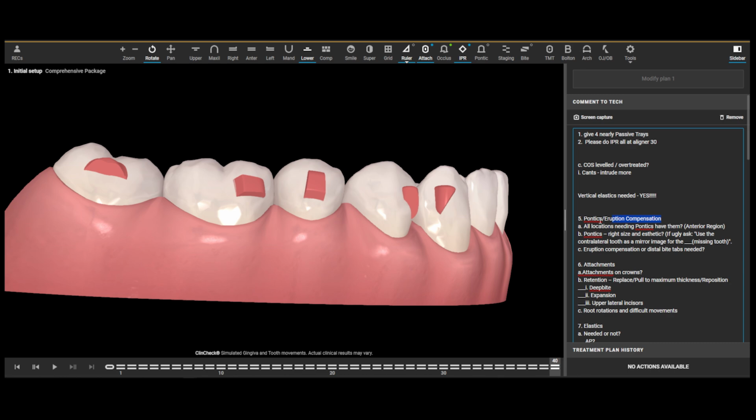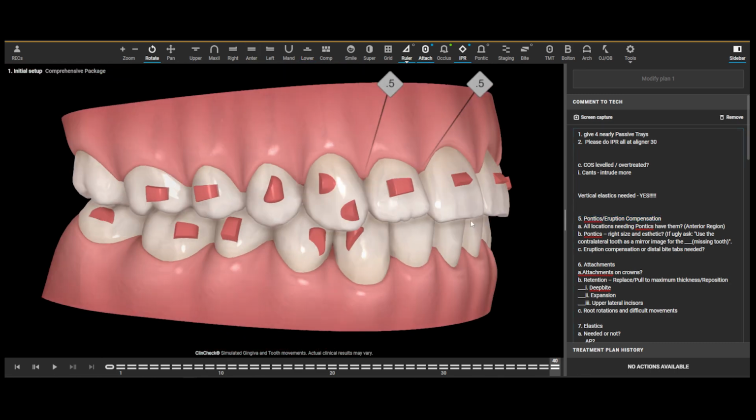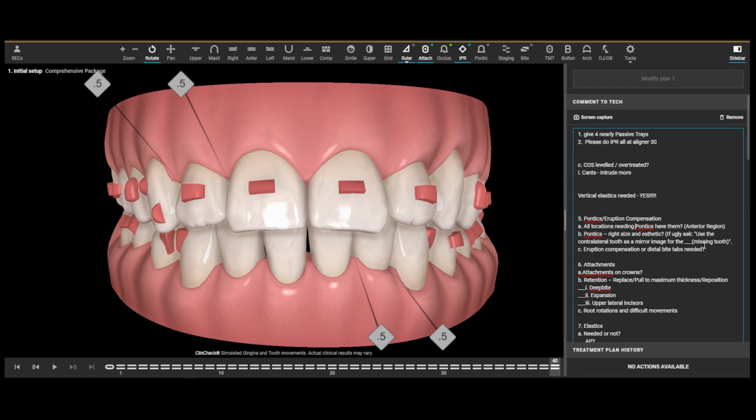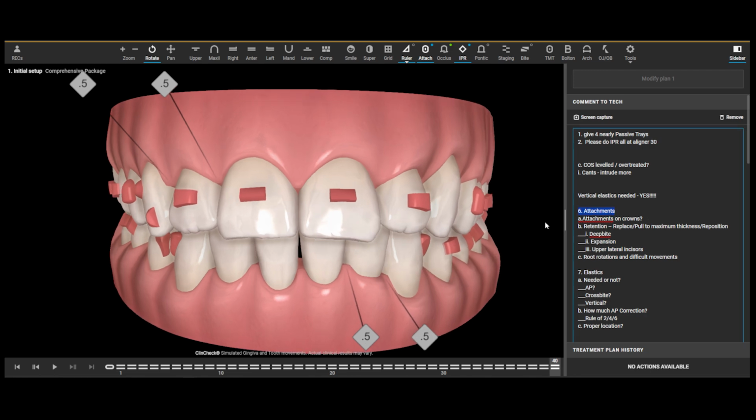Okay, so pontics and eruption compensation. Is this patient missing any teeth? Negatory, nothing. It's all there. So the entire pontics and eruption compensation section goes bye-bye. All right, what's next? Attachments. So are there any attachments on crowns? There's not. We already looked at our plan earlier.